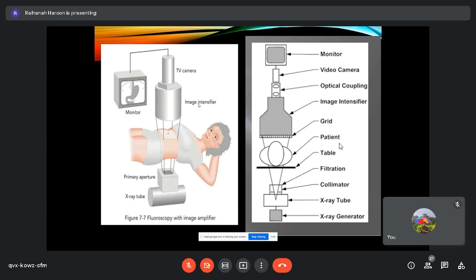I think last year or two years back, something happened in anesthesia in the ICU, whereby an anesthesiology medical officer was not aware of the difference in function between a fluoroscopy machine and an X-ray machine. One of our radiographers, a junior one at that time, went up and was supposed to perform a portable chest X-ray. At that time, this MO was inserting a nasogastric tube and, unfortunately, was unsure of the position.